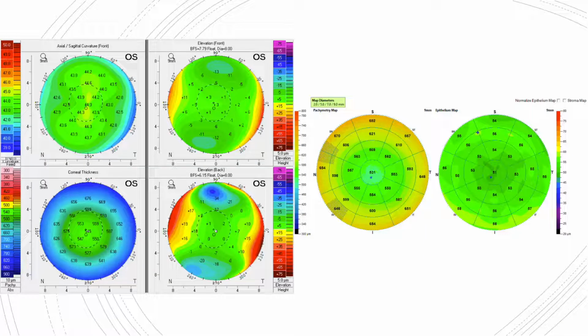Now, the use of epithelial thickness maps in refractive surgery evaluations has been well demonstrated. This is an example of a patient who might have been offered corneal refractive surgery based on tomographic findings that do not demonstrate any blatant abnormalities. There is a subtle truncated bow tie on anterior curvature, so perhaps this patient might have been offered a less biomechanically destabilizing procedure such as PRK, but this is essentially a patient who would have been offered a corneal refractive procedure based on tomography.